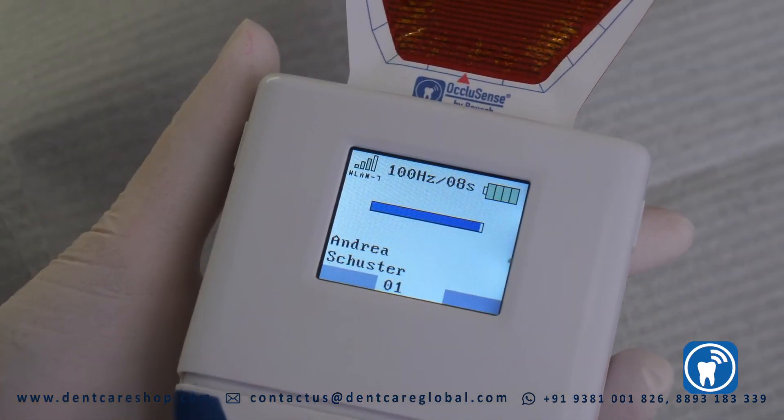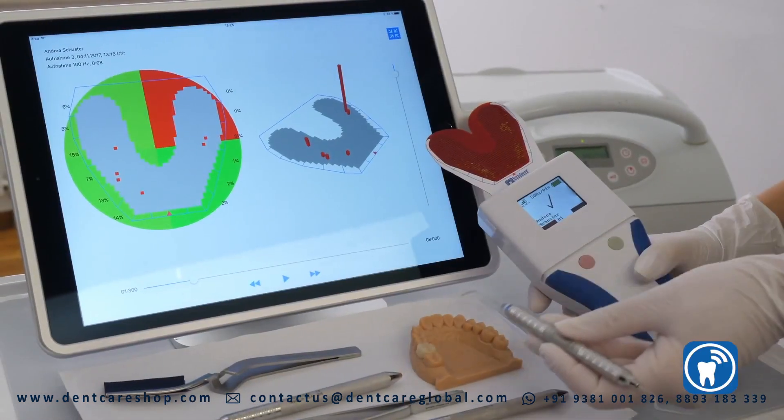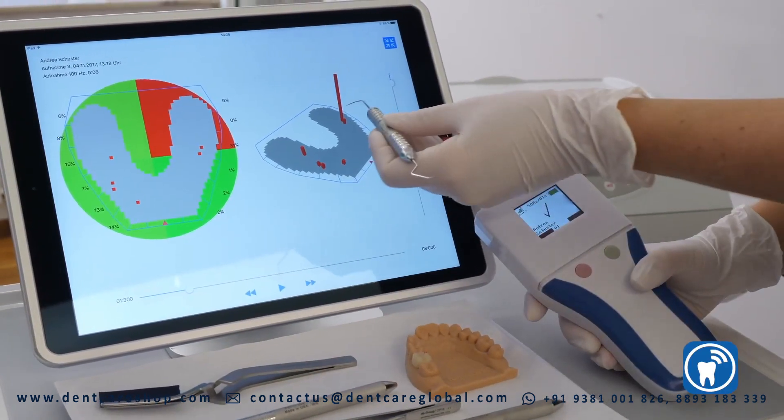The traditional color transfer on the occlusal surfaces of the patient facilitates the assignment of the high spots to the pressure graphs shown on the iPad.